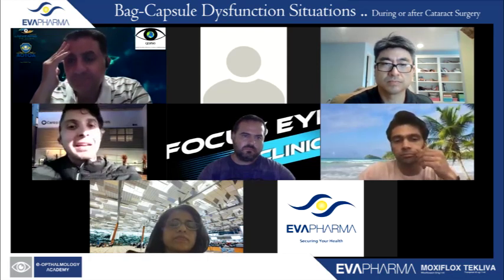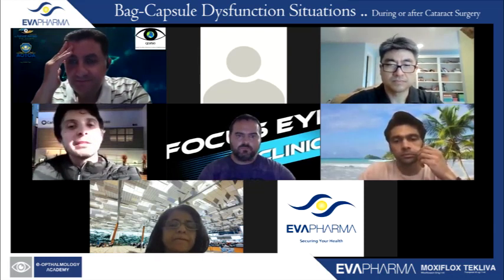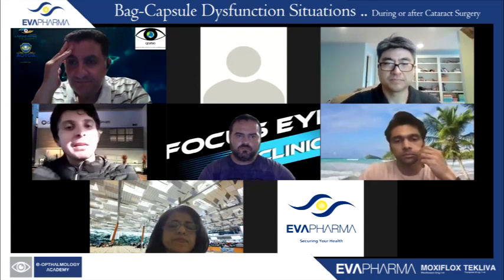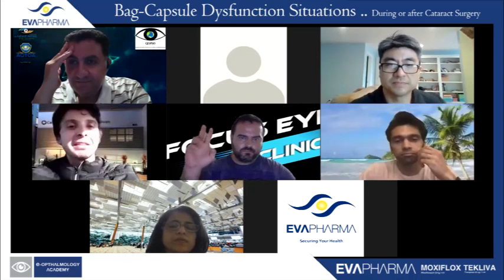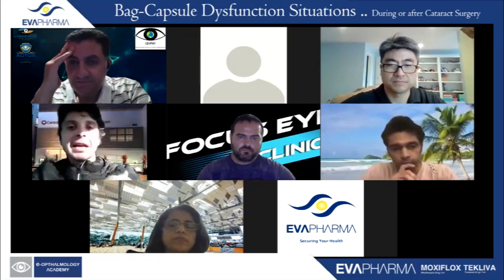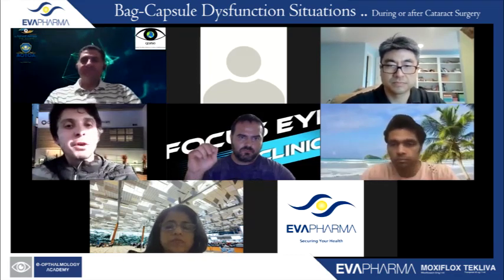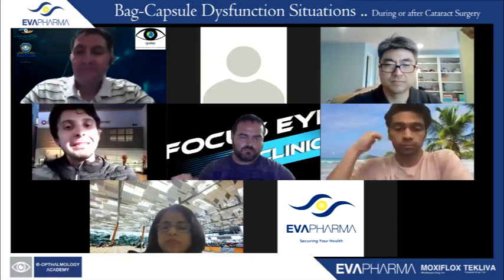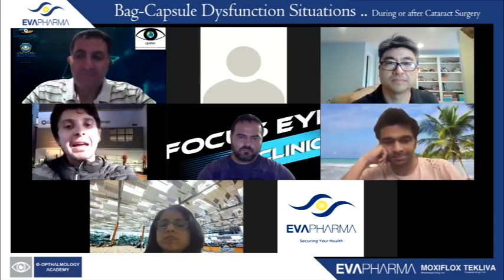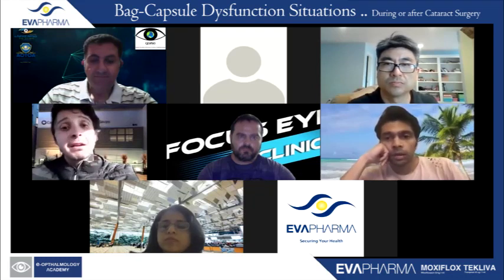They are stable too in the sclera. I showed in this talk a video that simulates a flange in silicone like a sclera. You can see I pull the flange, and you can see the silicone tilt. Do you remember this video? Yeah. It's so stable. When you do it in the sclera, man, it is so difficult to remove. I have some videos to show how stable it is, simulating a sclera.